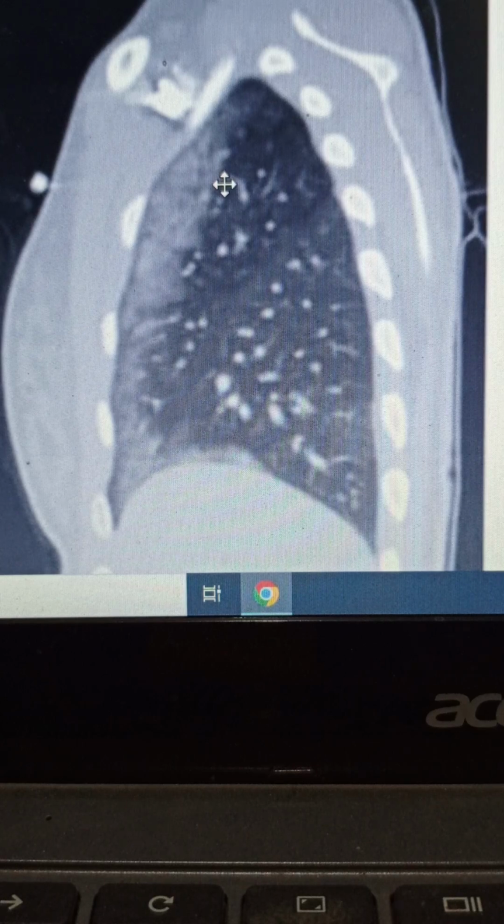As we have completed our pulmonary section in medicine, now we will discuss all the pulmonary cases that we will be looking at in a surgical unit. So today we are going to discuss a pulmonary case of surgery, a case of a patient who had an injury and came to the emergency with increasing shortness of breath.